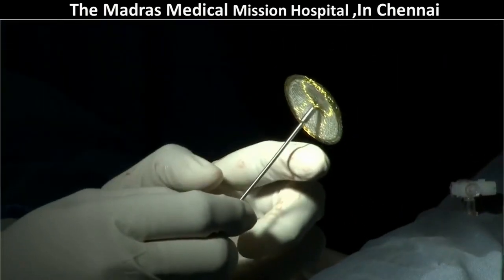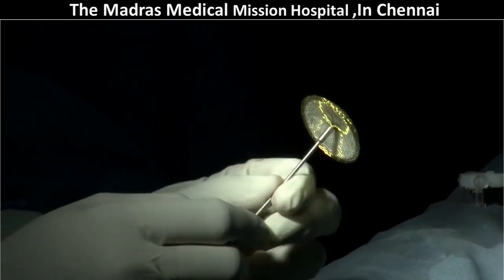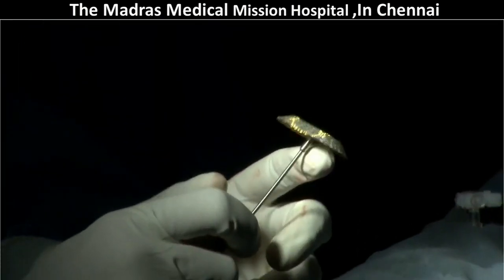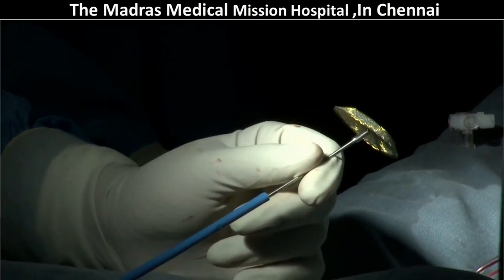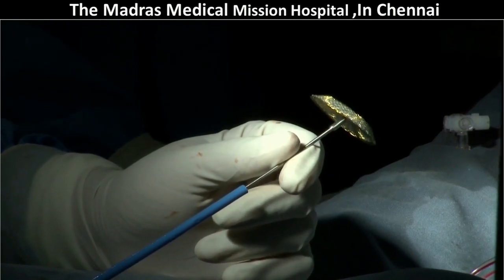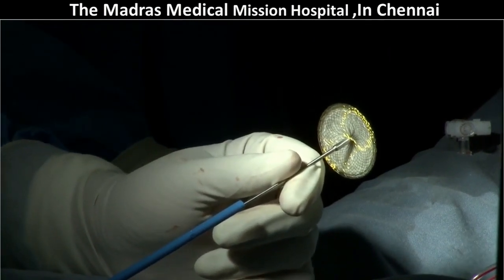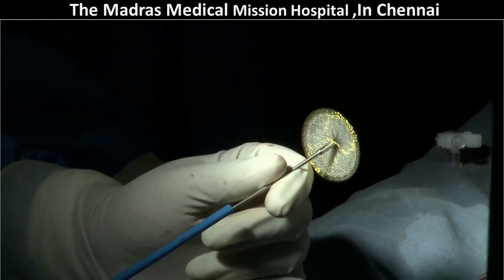The second thing is, unlike an Amplatzer, LifeTech, Cocoon or any other device which are mounted with a screw, their device will be perpendicular to the cable. So very often what will happen is, if the atrial septum is not perpendicular to the inferior vena cava, the device will be held with some tension, and often when you release, the device will jump back to its natural lie of the atrial septum, and that particular situation might give us a little anxious moment.